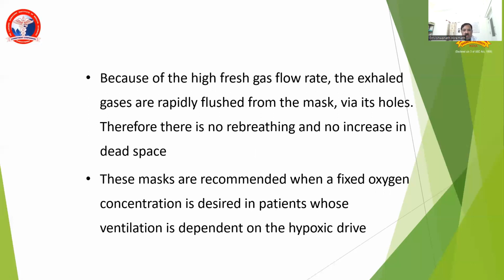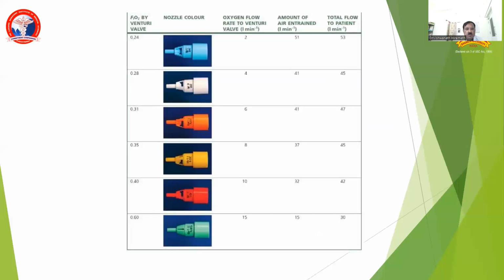These masks are recommended when a fixed oxygen concentration is desired in a patient whose ventilation is dependent on hypoxic drive. They are color coded.